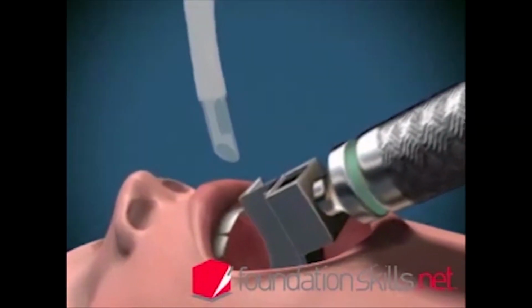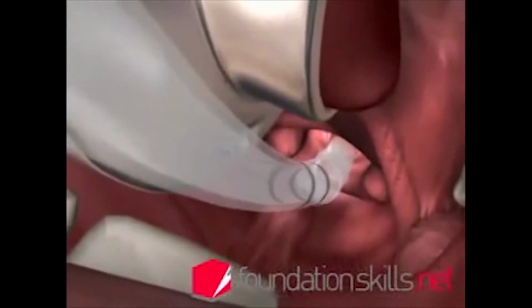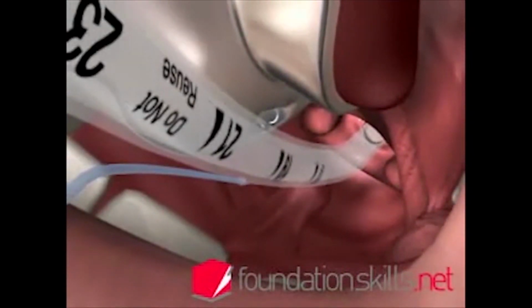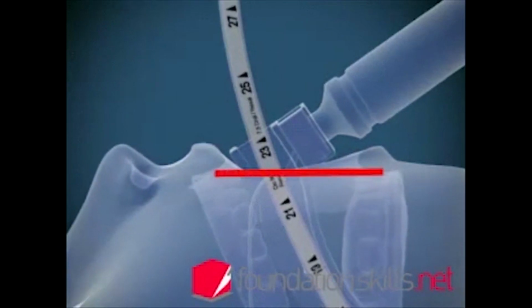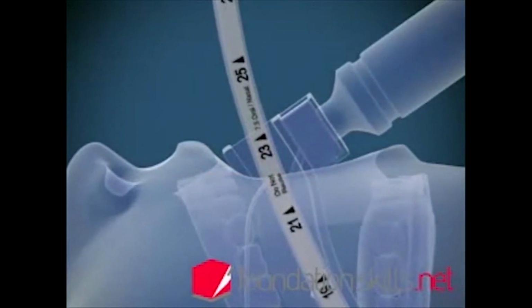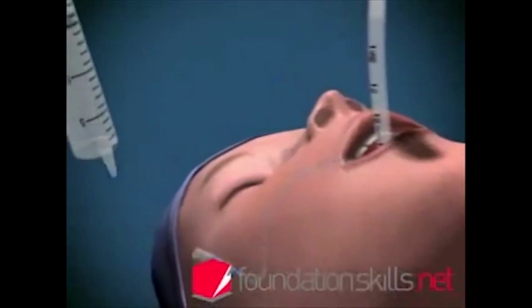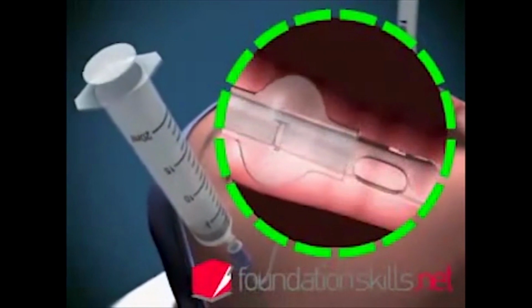With the right hand, insert the endotracheal tube from the right-hand side of the mouth directly between the cords and into the trachea until the cuff passes through the cords. The markings on the tube at the incisors will show between 21 and 24 centimeters in the average-sized adult when the tube is in position. Remove the laryngoscope and inflate the cuff with approximately 15 mL of air to prevent air leaking during ventilation.